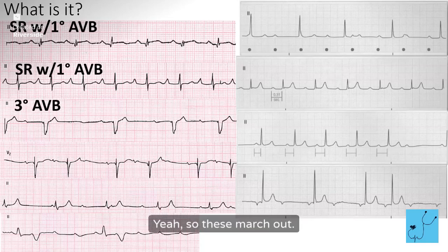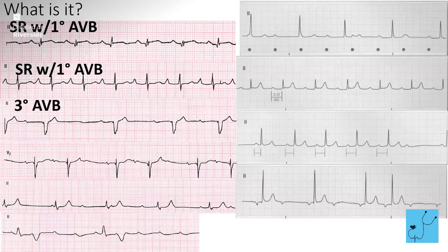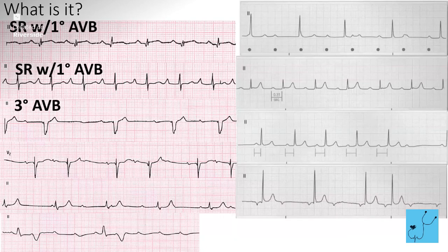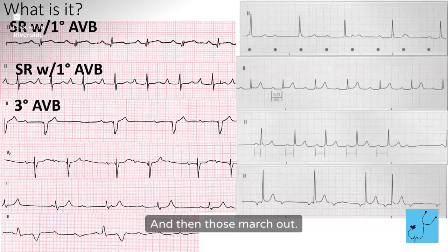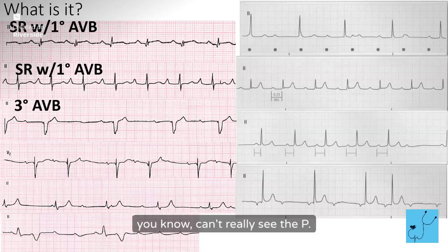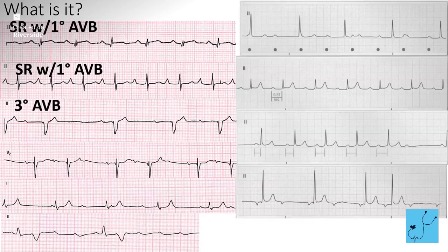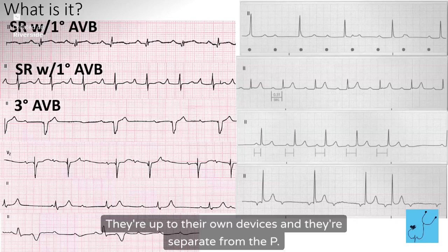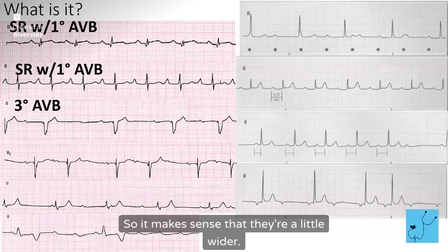Yeah, so these march out. And the P, I don't know where the P is, so I need to find 2. And then those march out. I almost want a longer strip because in this area you can't really see the P. And these are a little wider because the ventricles are doing their own thing, right? They're up to their own devices. And they're separate from the P, so it makes sense that they're a little wider.